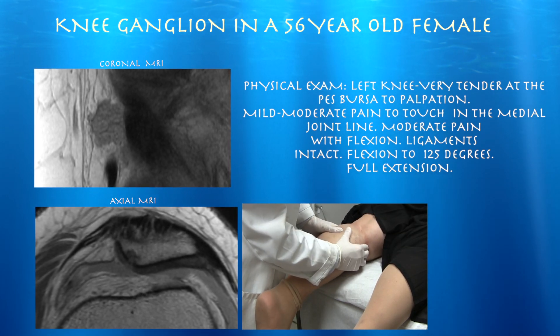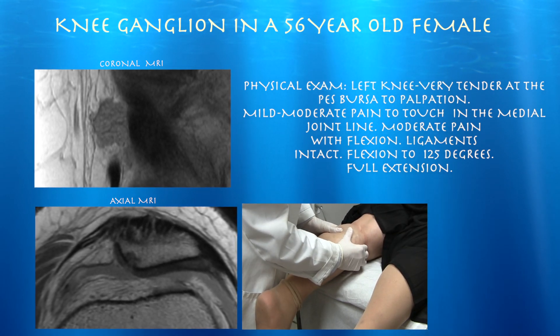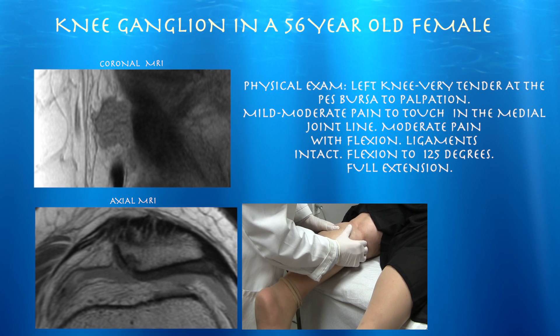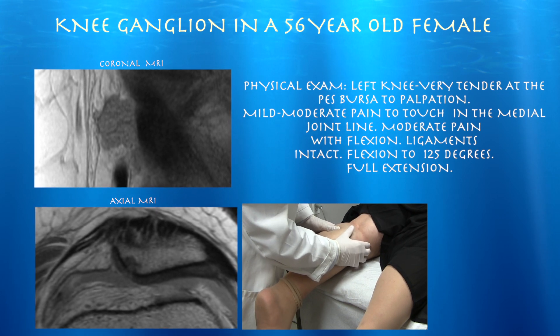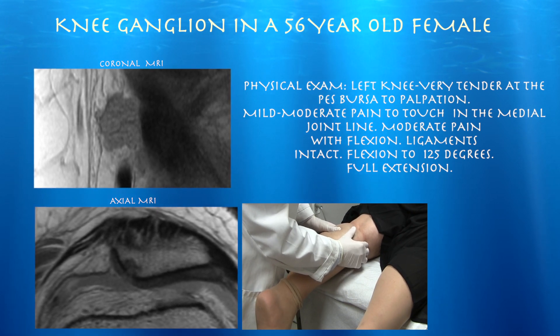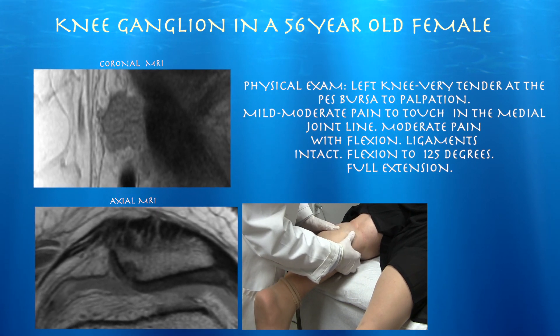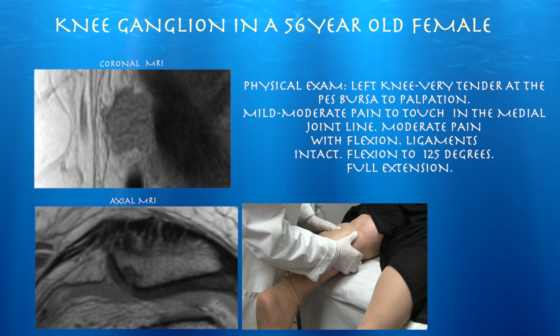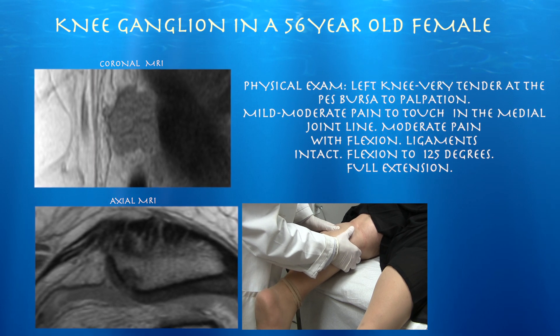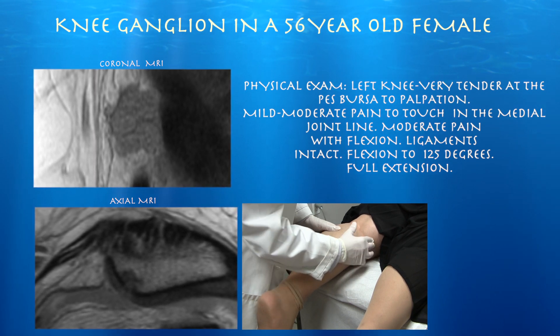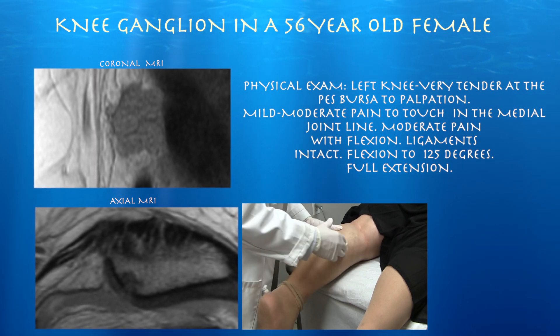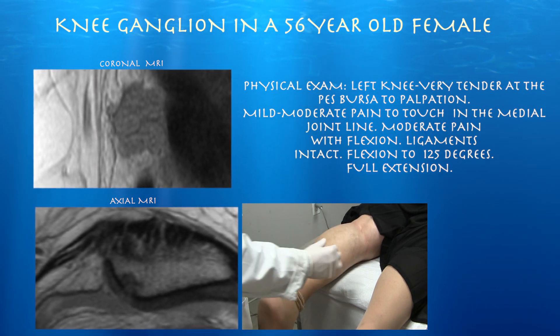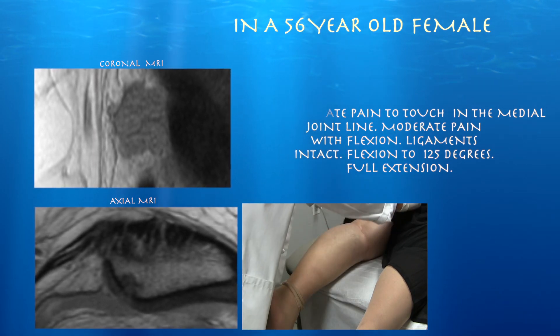Are you real tender over here? Yeah. You complain of pain here? Yeah. Well, most of your pain seems to be up here — so this is anterior. The cyst, I believe, is right here, just medial to the semimembranosus tendon.